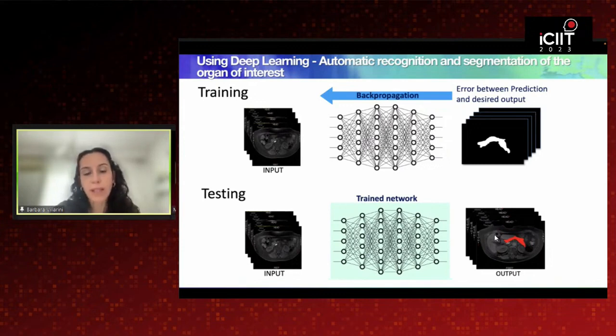So when we then go to the testing stage, an unseen image volume, something that we didn't use during the training process, is processed through the fully trained deep learning network, which performs a pixel-wise or voxel-wise prediction in order to generate the output as a sequence of 2D slices or a 3D volume differentiated by pancreas and not pancreas labels.